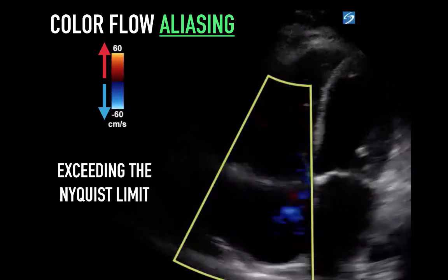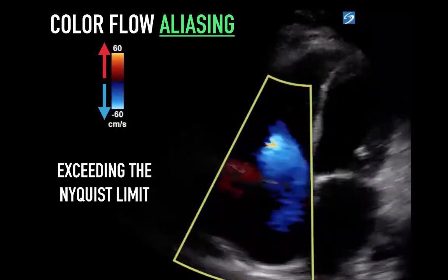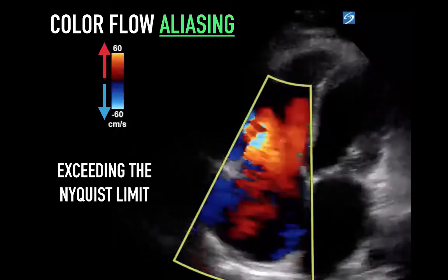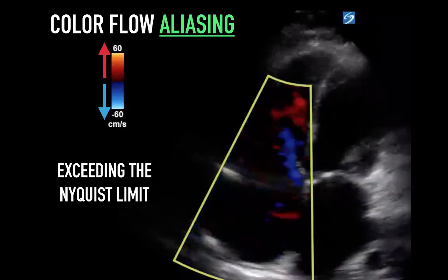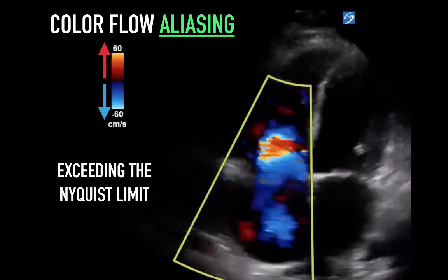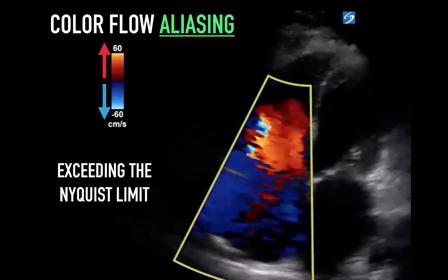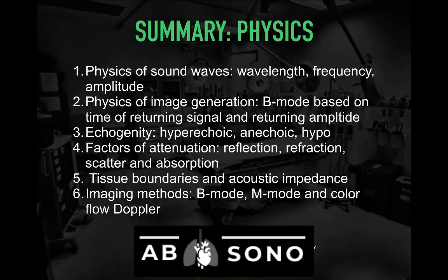This is much like looking at the propeller on a prop plane. At a certain frequency, we can no longer recognize the direction the prop is spinning in. In this case, the machine can no longer interpret the direction and velocity. This can help pick up areas of flow acceleration, like those of stenosis and regurgitation, where blood is pushed through a pinhole. So we've covered an array of topics from physics of sound wave generation to echogenicity to color Doppler.